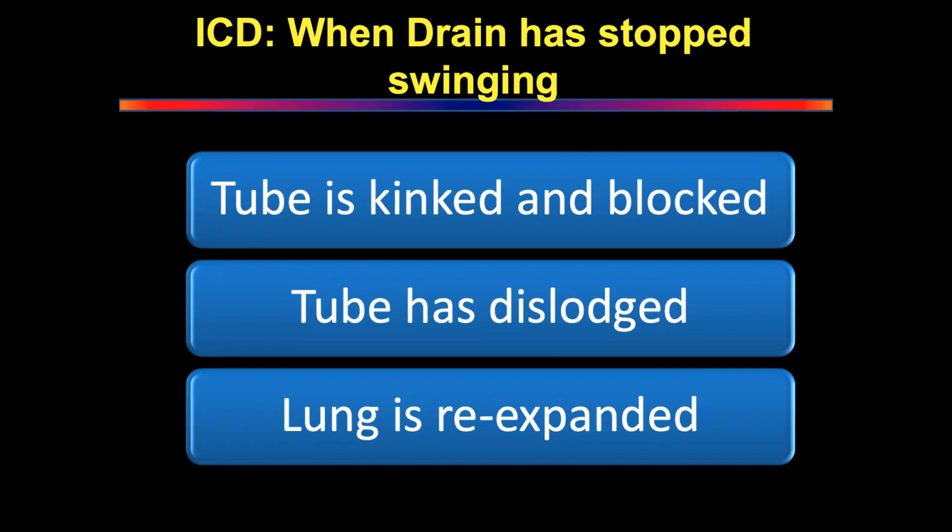Yes, sir, but sometimes on suction the last one can stop. Yeah, when the lung is re-expanded, the swing will reduce. It will go away because it will push the drain against the lung, against the pleura, and all your holes are blocked when the lung re-expands. So these are the 3 answers. It's all self-explanatory, nothing complex about it. Quite straightforward. Happy or not happy? Yes, sir. Happy.